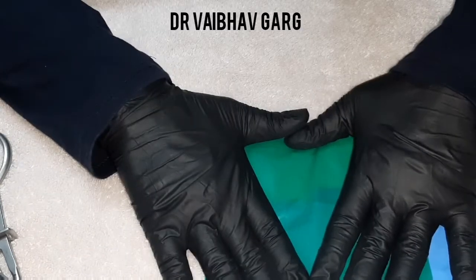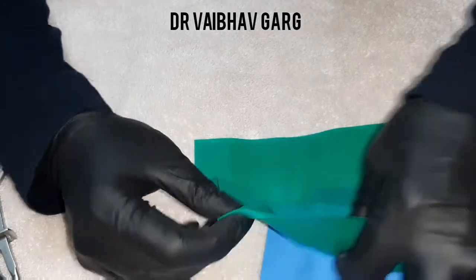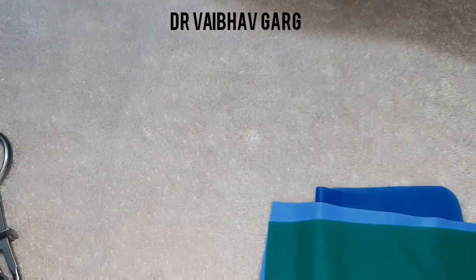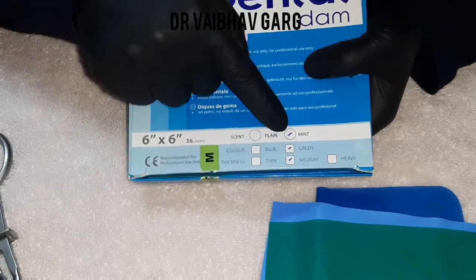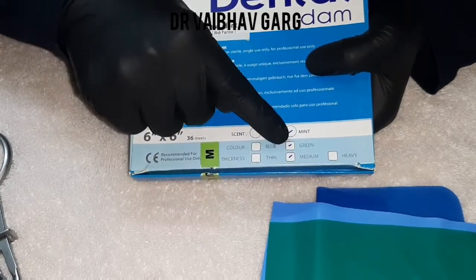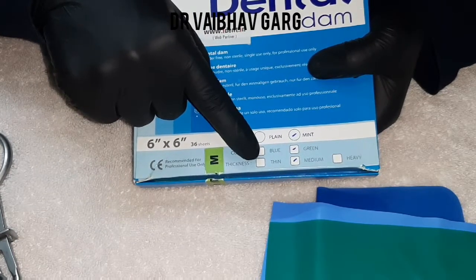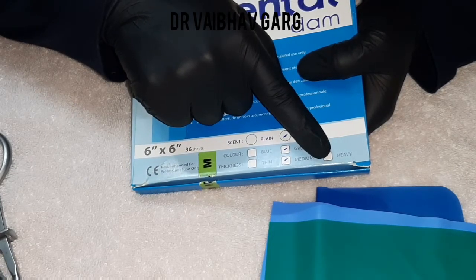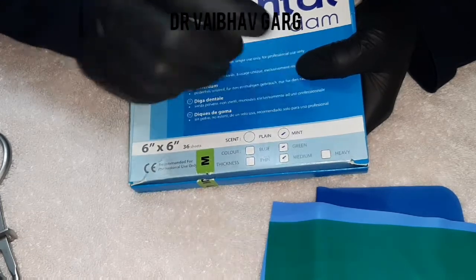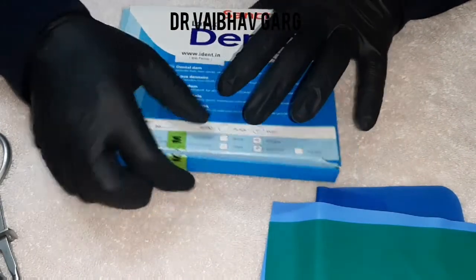Let's start with how to mark these sheets and how to use them. This one is mint flavored, medium thickness, and green in color. Blue is also available. Thickness can be very thin or heavy — the heavy consistency is used mostly for restorative purposes and is very good at reflecting or keeping the gingiva away from the restorative surface.